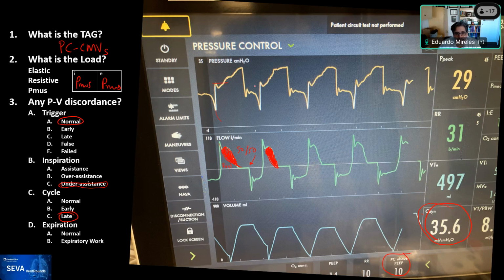What it helps me see is where the ventilator actually pressurized to, and that helps me visually start seeing where the patient would be pressurized if the patient is not actually exhaling against it. So you see how it's not. Sometimes we can have one like this one over here, where perhaps the patient was a little bit more relaxed and it plateaus.